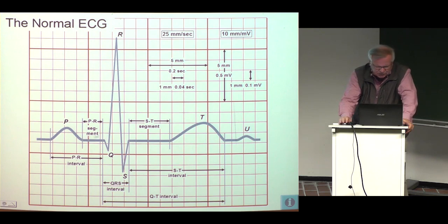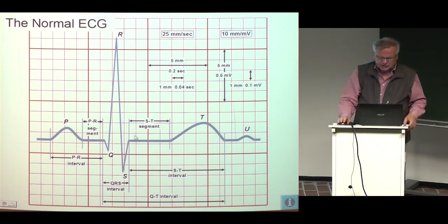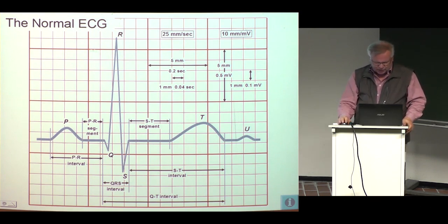regions or segments or intervals, PR segment, PR interval, QRS interval, QT interval, ST interval, and so on. You can find how they are here. And the standard ECG recording paper, and of course today on the computer screen and the monitors, is shown here, which gives the easy visual scale for the signal.